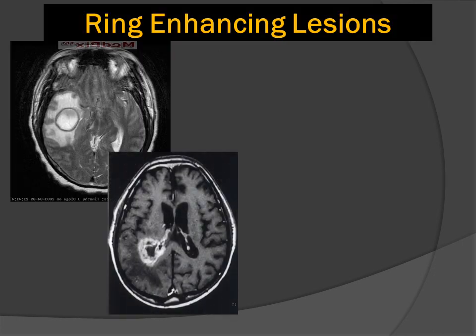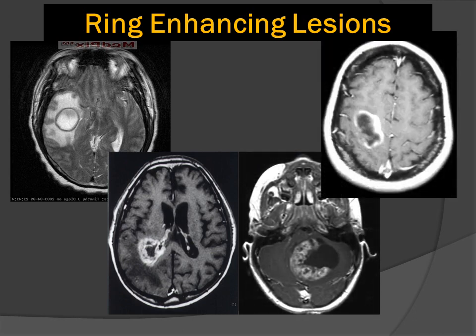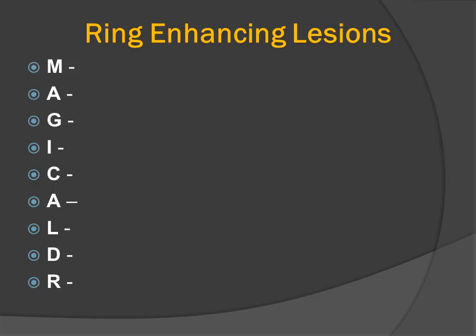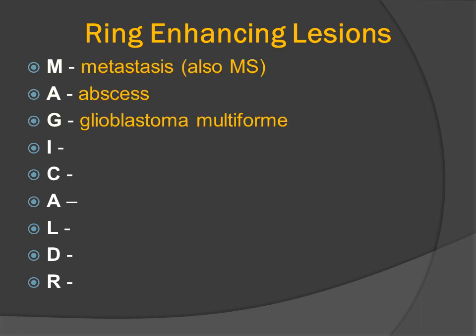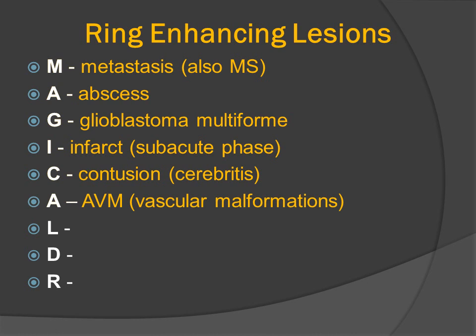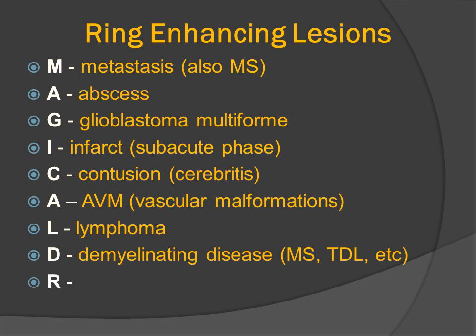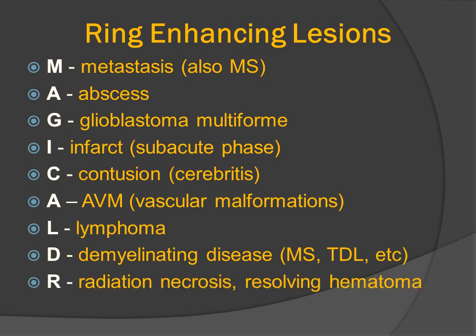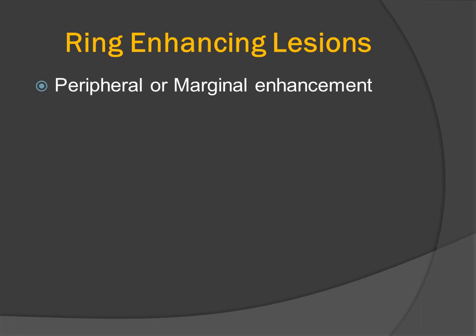Ring-enhancing lesions are a very common differential diagnosis in neuroimaging. Here we see four different patterns of ring-enhancing lesions. Many people use the mnemonic MAGIC DOCTOR or MAGICAL DOCTOR to remind themselves of the many different kinds: metastatic disease and multiple sclerosis, abscess, glioblastoma multiforme, subacute infarcts, cerebritis and contusion, AVMs and vascular malformations, lymphoma, demyelinating disease including tumefactive demyelinating lesions, and radiation necrosis or resolving hematomas.